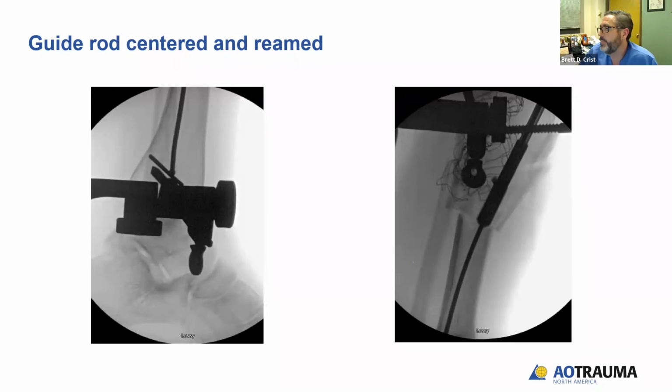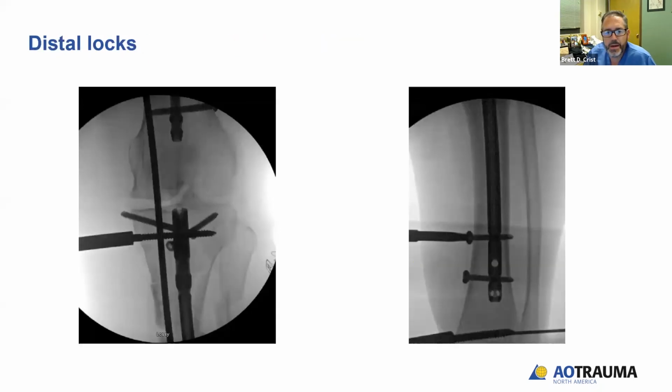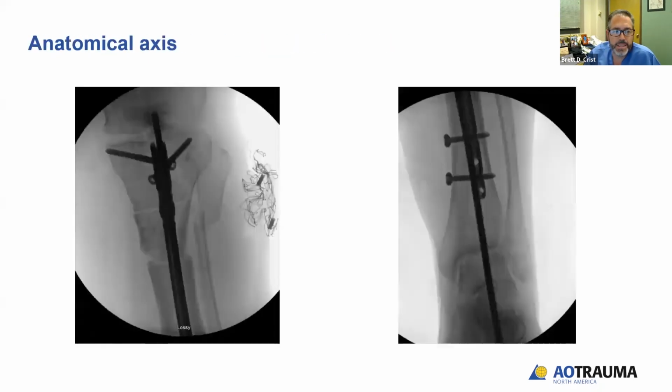Yeah, I may have. It did change more on the sagittal plane, but I was a little worried about getting the nail into the canal without losing some of the correction if I didn't have that flexibility more proximally. Sure, with that amount of correction. But I sure could have tried.